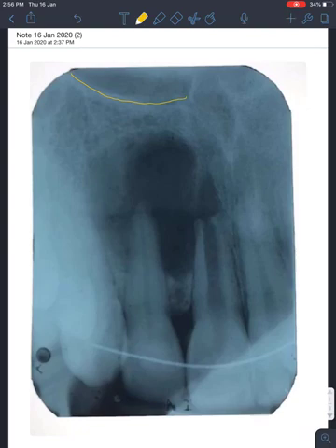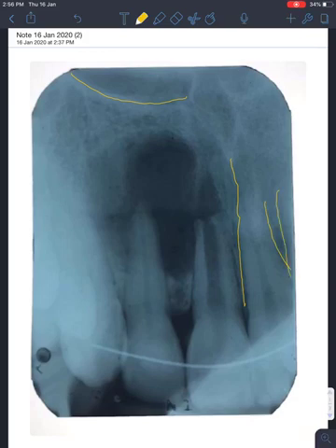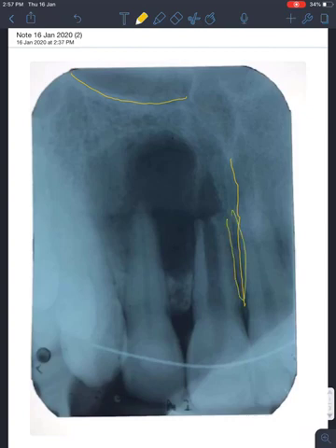Anything else? Intermaxillary suture. What is that? Intermaxillary suture. Okay, anything else? Incisive canal. Where should the incisive canal actually be? It should be between the teeth somewhere there. But in this radiograph we're not able to see it very clearly — it's still there.